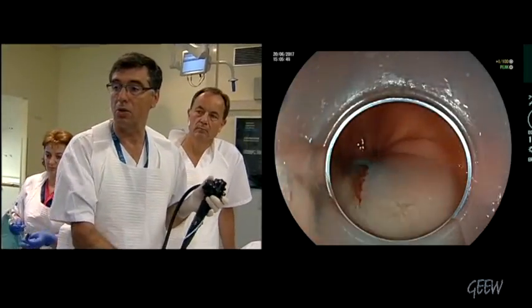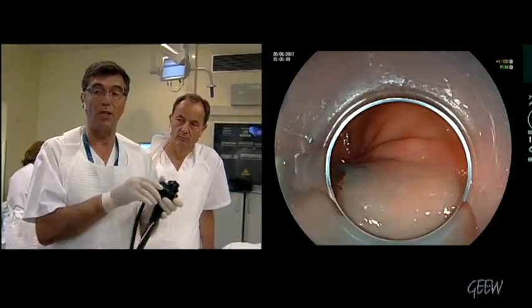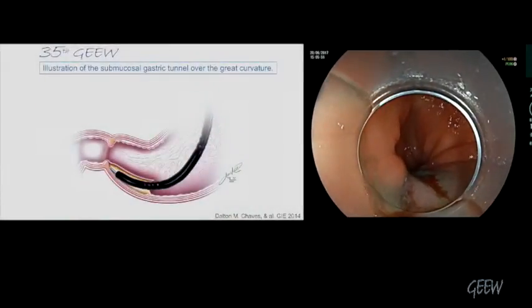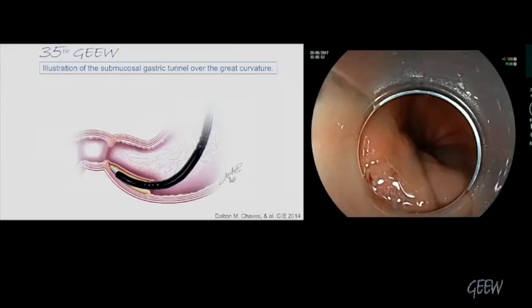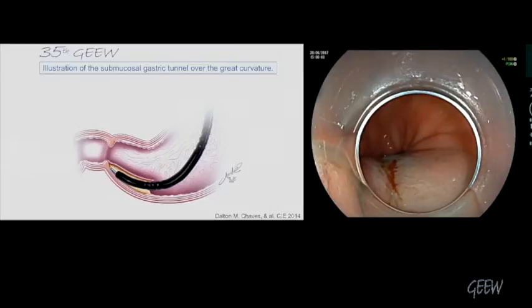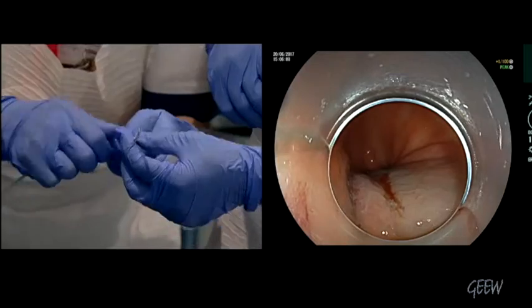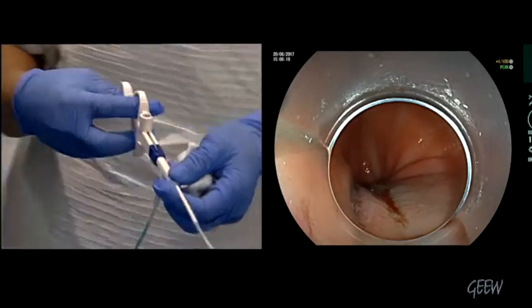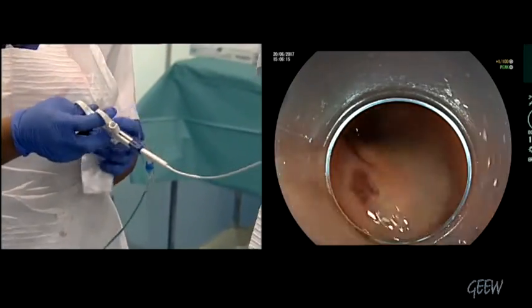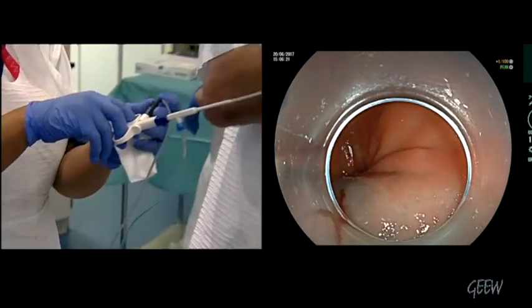The aim is to do a short tunnel to be in front of the pyloric arch, and then to cut the pyloric arch. Now I'm going to use the TT knife G, which is a triangle knife, that allows mucosal injection. Horst will give some explanation about this new device. It has an additional channel so you can cut, coagulate, and inject.